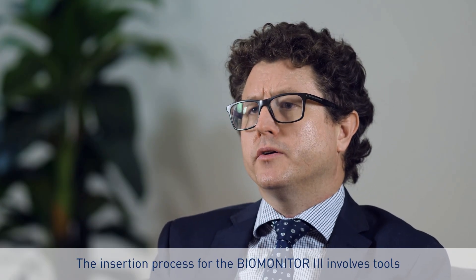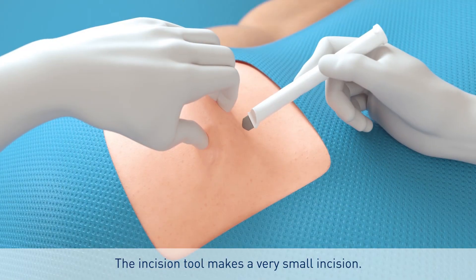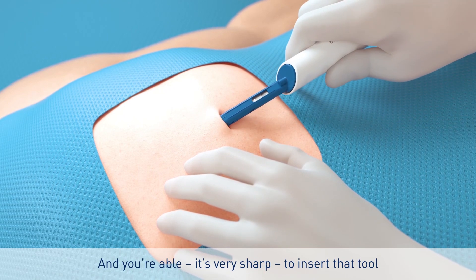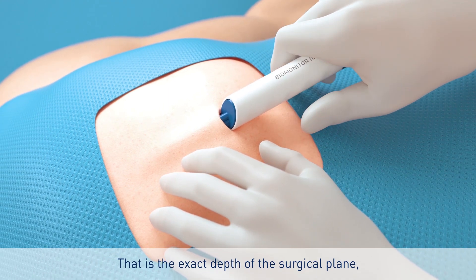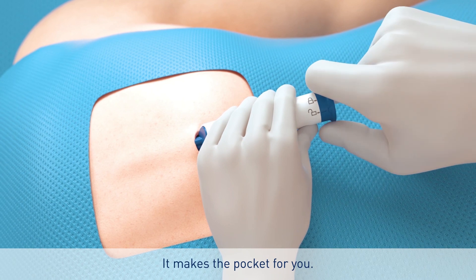The insertion process for the Biomonitor 3 involves tools which are really very helpful. The incision tool makes a very small incision and, being very sharp, you're able to insert that tool and it holds its own weight. That is the exact depth for the surgical plane for the device to be implanted — it makes the pocket for you.